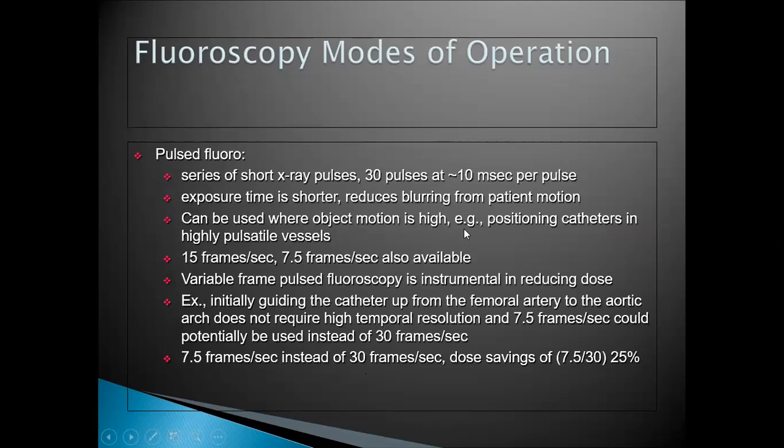Then there is pulsed fluoro. At times, for some heart studies, where there are so many vessels that are highly pulsatile, the rate at which blood is flowing through the vessels is very high, like in arteries, we have to use pulsed fluoro. Pulsed fluoro requires the use of very short X-ray pulses.